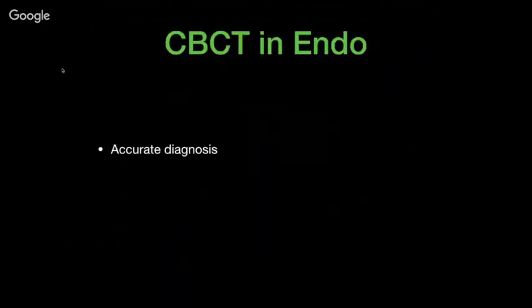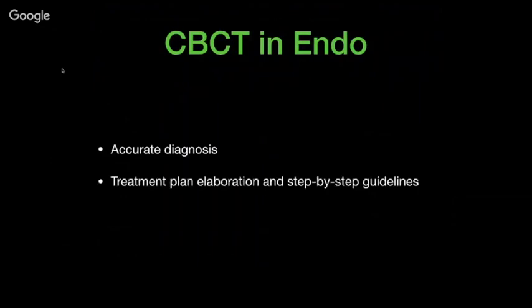So CBCT in Endo will help you develop an accurate diagnosis, will help you elaborate a treatment plan, and would guide you on a step-by-step procedure how to conduct it. And besides, for us, it is a valuable presentation for the patient, where instead of using an extracted tooth or a dummy that you have purchased, or even a model that you would have downloaded from the website, any tooth will be personalized on the patient's tooth, a personalized treatment plan, and a preview for what's going to happen during the procedure.